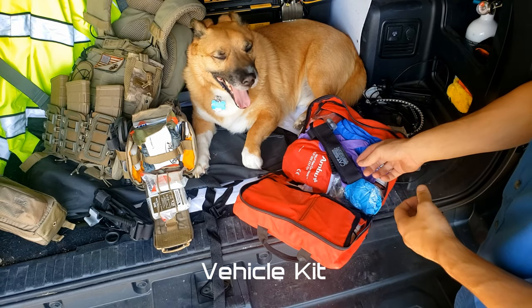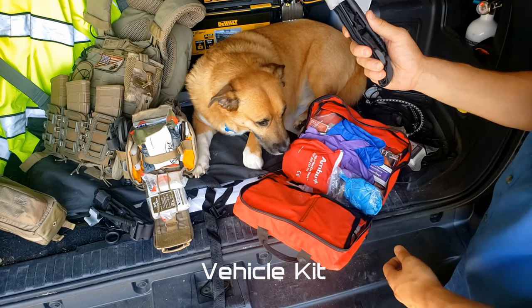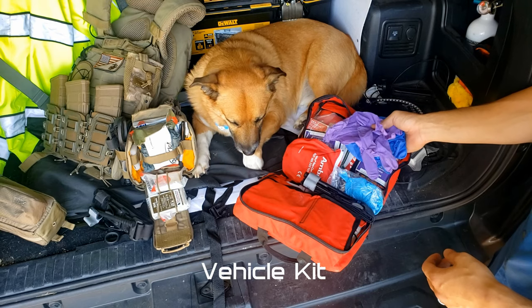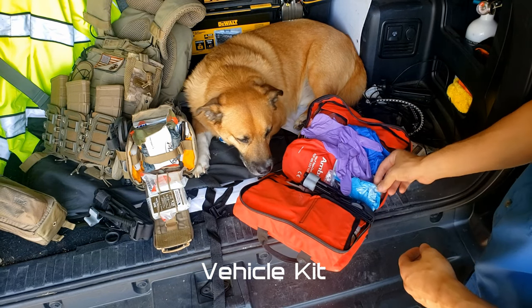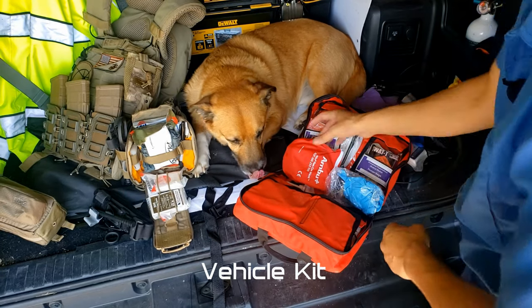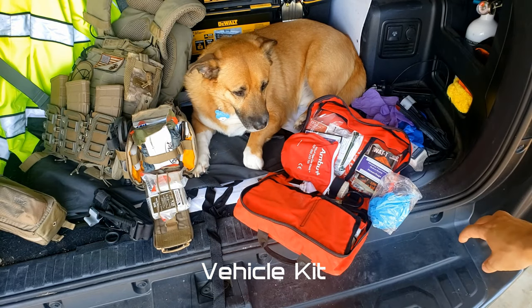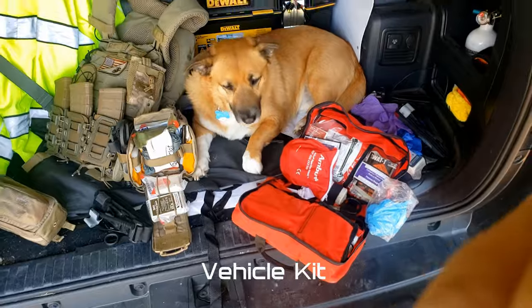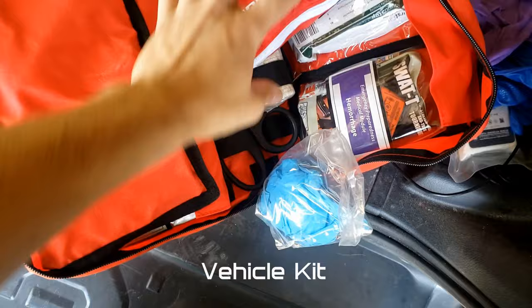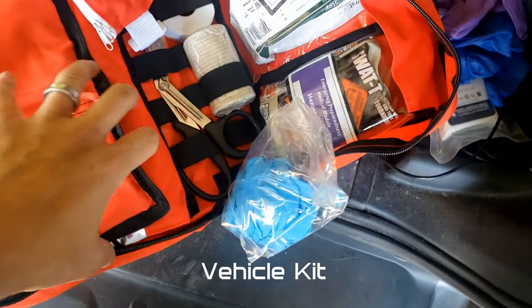So even though this is not the dedicated trauma kit, I still have trauma supplies, right? When I open it up in an emergency, the first thing that falls out is the tourniquet, pre-staged, like I mentioned. Gloves, PPE is important. Put on your nitrile gloves. If they're not easily accessible, you're not going to be able to find them in an emergency, okay? CPR mask in here. In fact, let me just take you guys off the tripod so I can show you. Trauma shears, bandage, tape, and I won't go into exactly how to use all this quite yet.